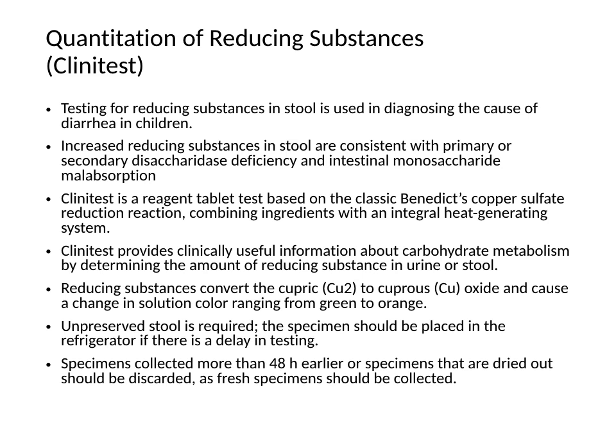Sometimes testing for reducing substances in stool is associated with disaccharide deficiency and malabsorption. The Clinitest tablet test depends on the Benedict copper sulfate reduction reaction. This test, which is very useful, provides information about carbohydrate metabolism. To use this test, we need a stool specimen, which should be a fresh specimen.